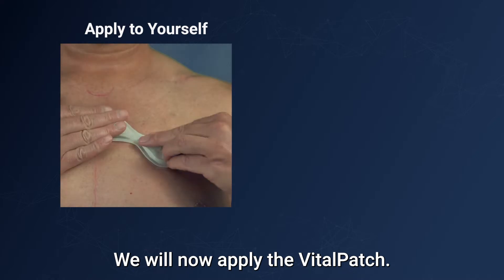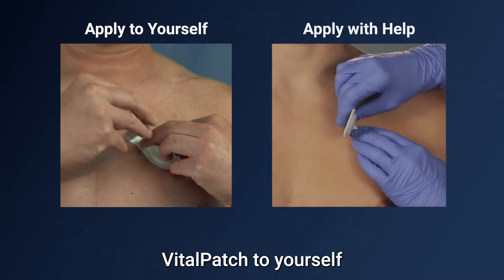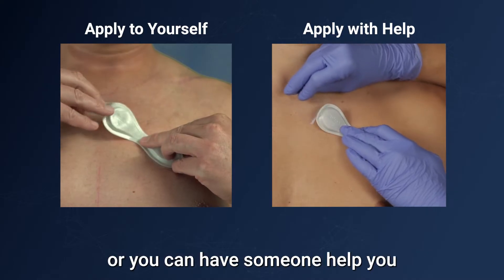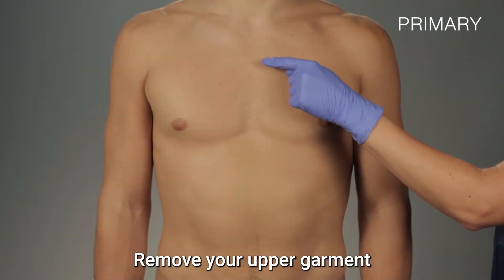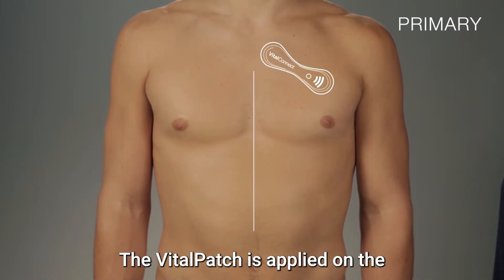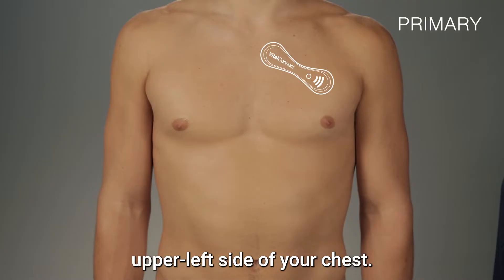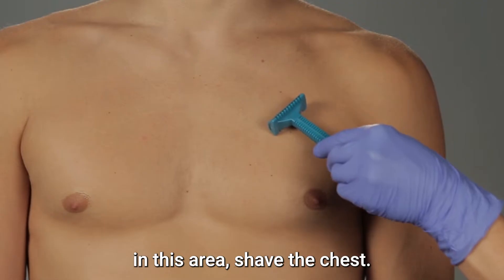We will now apply the Vital Patch. You can apply the Vital Patch to yourself with the aid of a mirror, or you can have someone help you apply it, as shown in this video. Remove your upper garment and find where the Vital Patch will be applied — on the upper left side of your chest. If there is hair on the chest in this area, shave the chest.